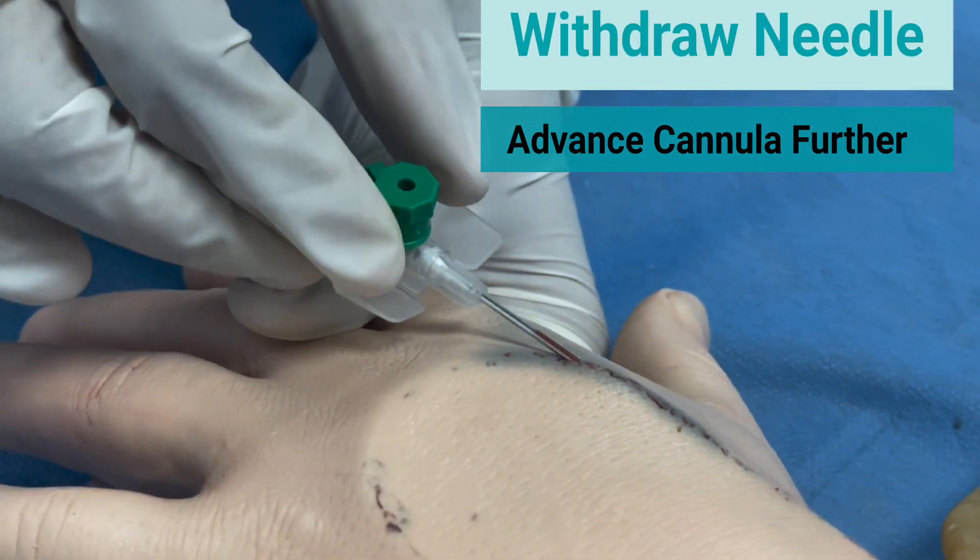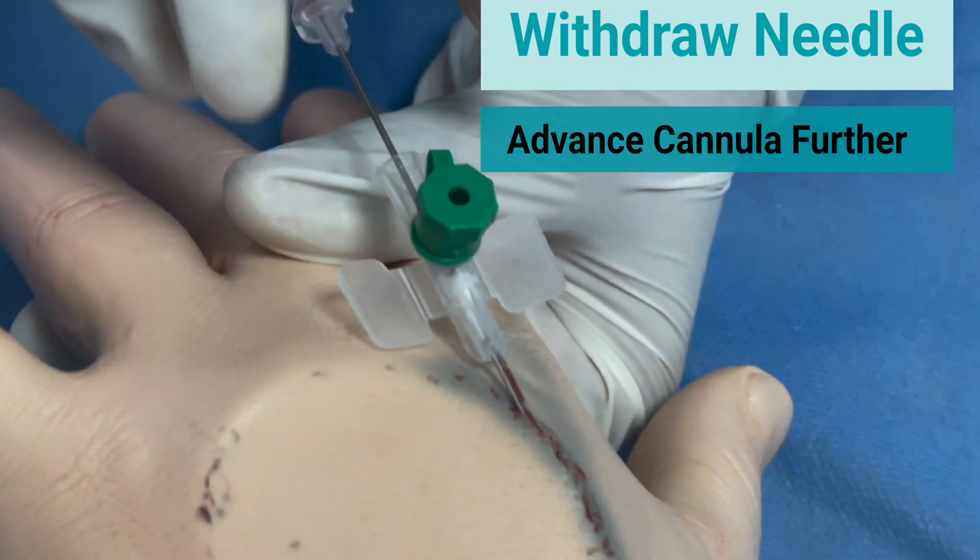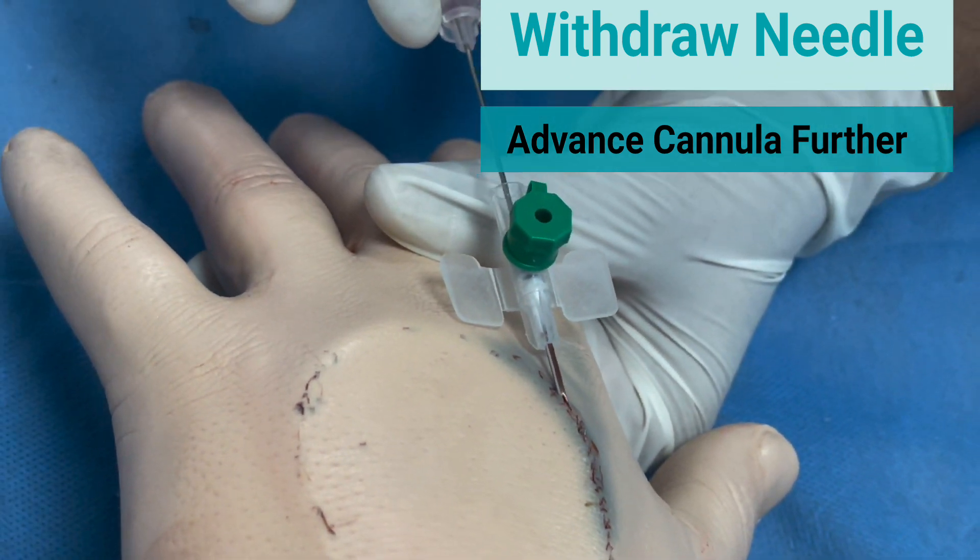While advancing the cannula further, keep withdrawing the introducer needle as shown.